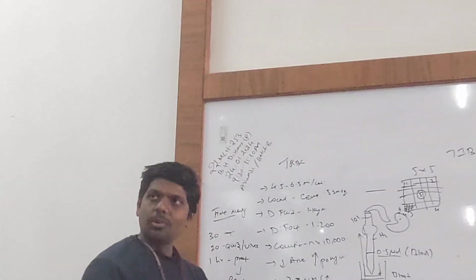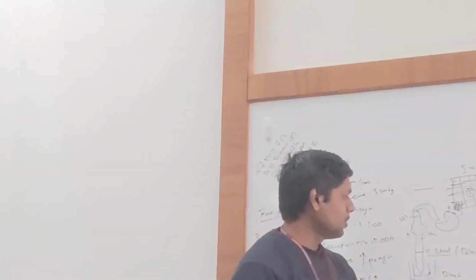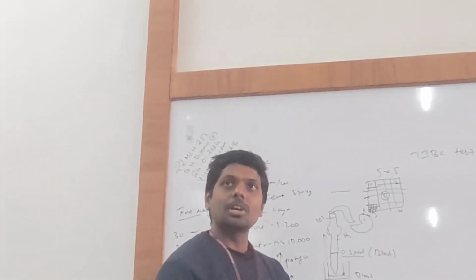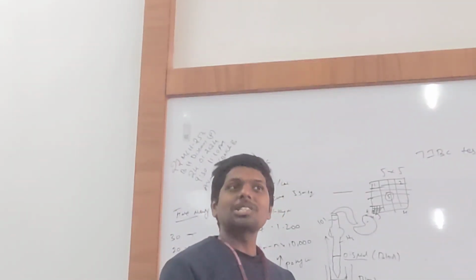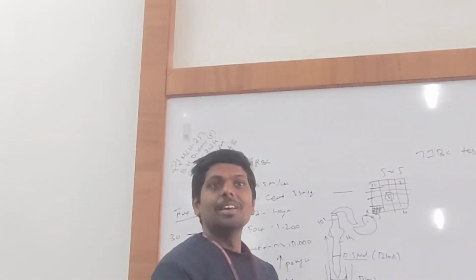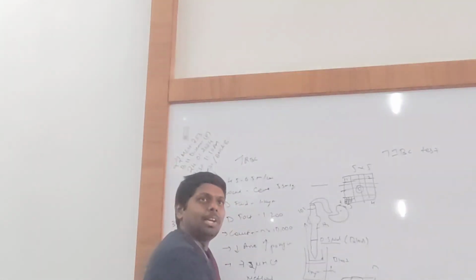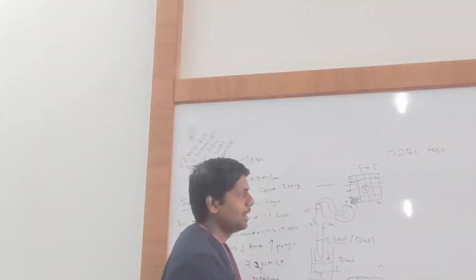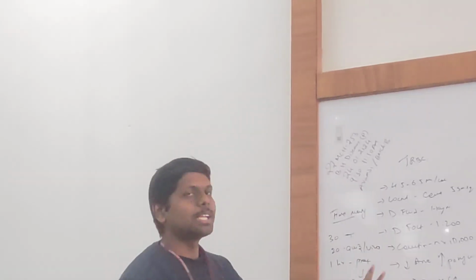Okay. The first and foremost thing is proper homogenization or proper mixing, then going for counting. Okay. It will take time, but you need to count it. So far, no one has counted properly for past 1 year in this lab. Try to count the cells. Okay. At least try to count one box properly. Then we can guess others. Okay. Try to count at least one box. Okay. 1 square I mean. Is it clear? This is all about the total red blood cell count.